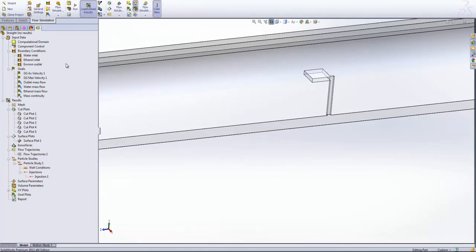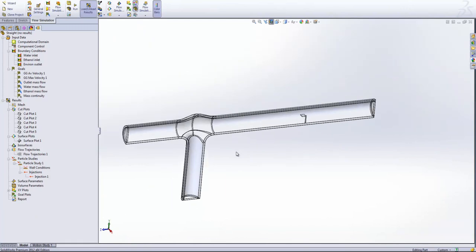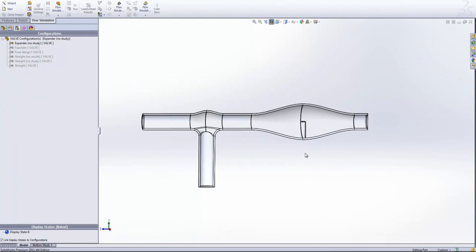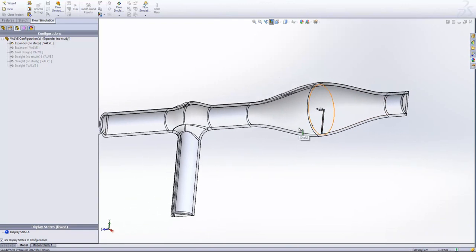Okay, so we've determined now that perhaps our design as it stands isn't really doing what we're after, so we might have to go and make some improvements. So let's go and have a look at studying a slightly different configuration with, I've called it an expander, but essentially it's a bulge in the tube which by my reckoning is going to expand the flow and cause it to diverge and slow down, which should hopefully enable the fluid to mix a bit better. So let's have a look at studying that.